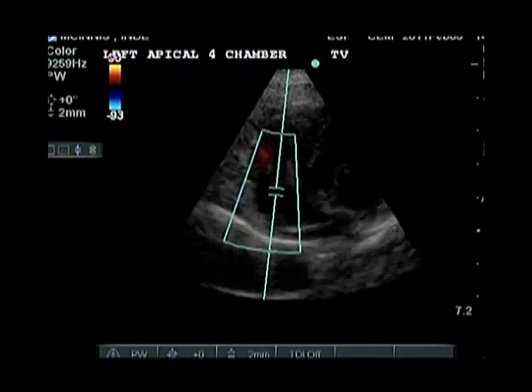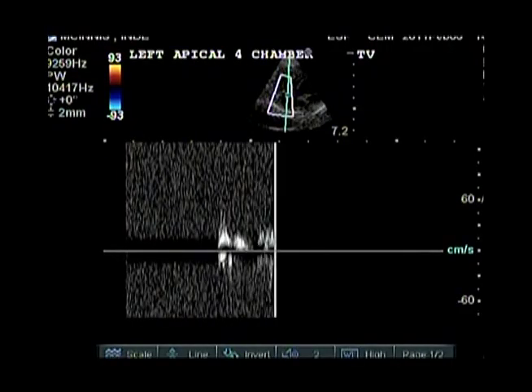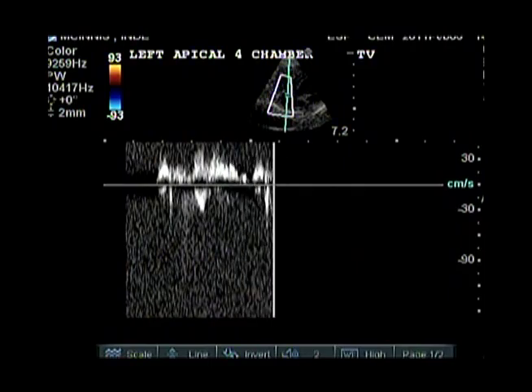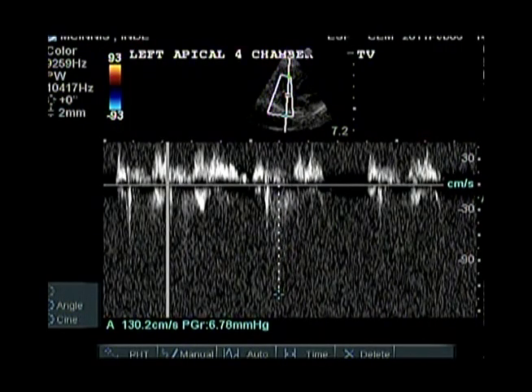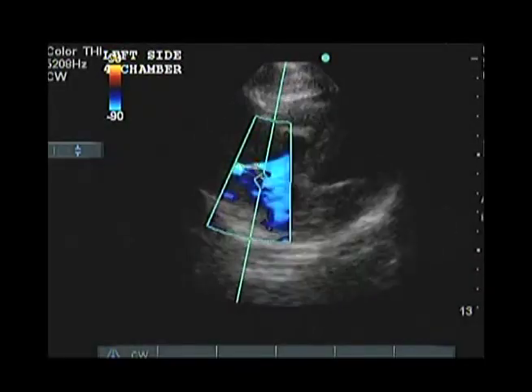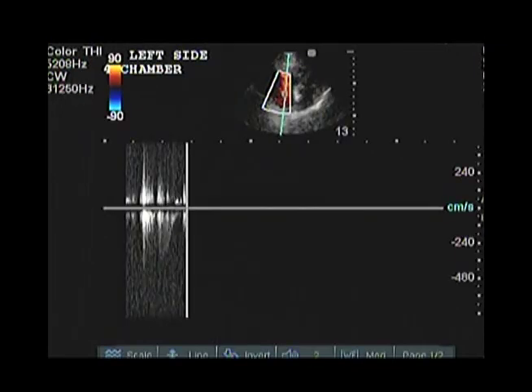Most ultrasound machines do not have a standard calculation for tricuspid insufficiency, so choose standard calipers and measure the greatest flow. Label the image tricuspid insufficiency, or TI, and save the image. Your measurement of the tricuspid insufficiency will also give you a pressure gradient.